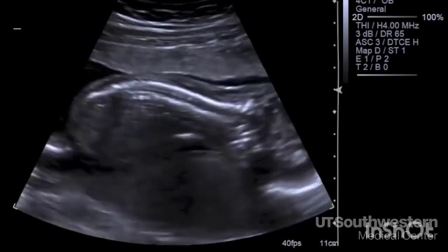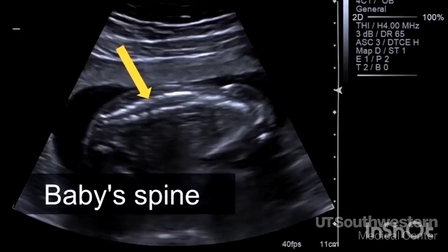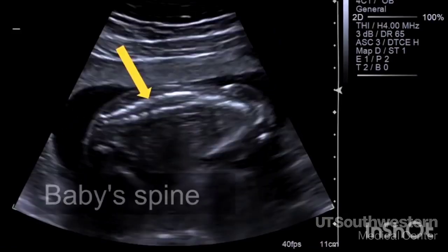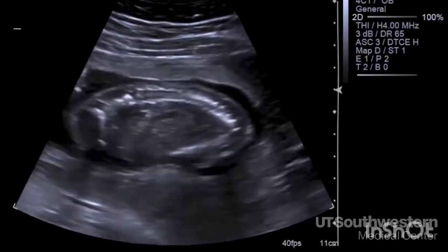This is the spine. We look at the region of the neck, the middle of the back, and all the way down to the sacrum or tailbone where it comes to a V. These views help us detect spina bifida. You can also see the ribs coming off the back.